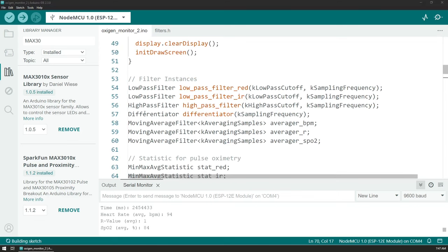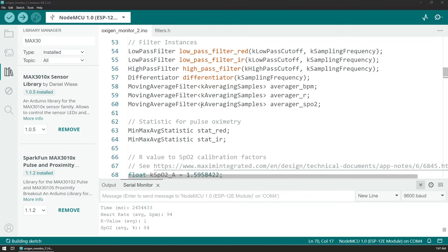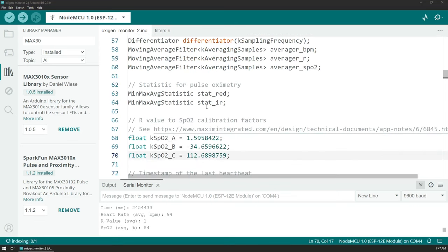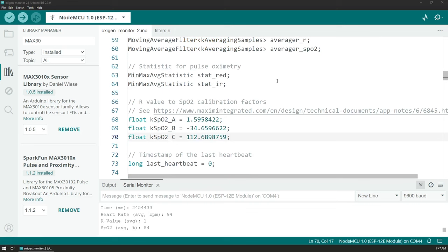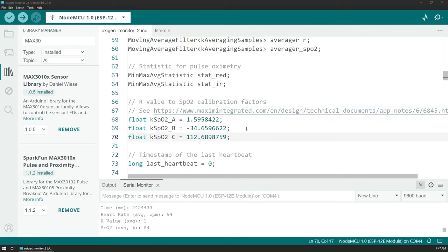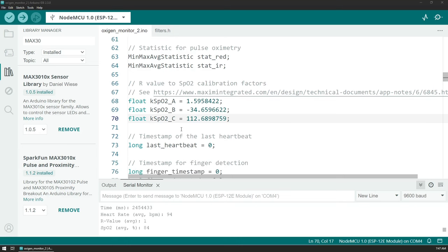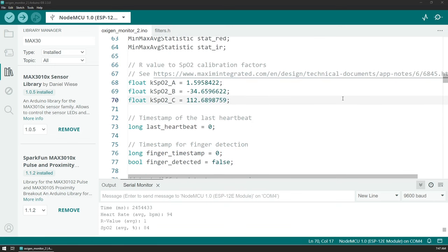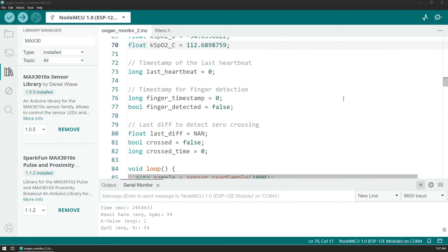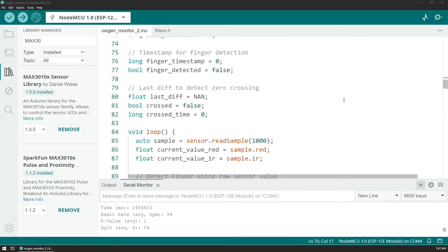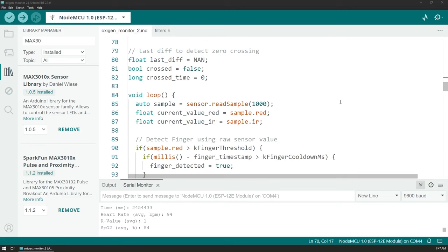We also have some calibration values for the sensor based on the documentation here. However, I just left the defaults because I don't have another oximeter to compare to and to modify these variables. We'll see them down in one of the equations that are used. There is on this link here a full explanation how you can adjust those based on your sensor if you want to.